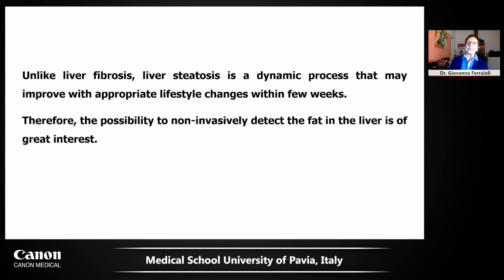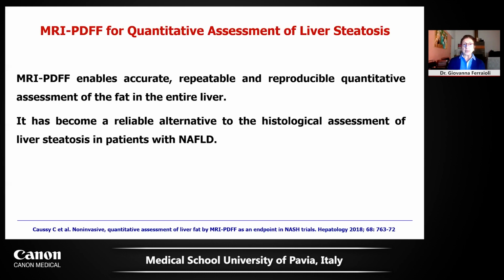On the other hand, liver steatosis, unlike liver fibrosis, is a dynamic process that may improve with appropriate lifestyle changes within a few weeks. Therefore, the possibility to non-invasively detect the fat in the liver is of great interest.